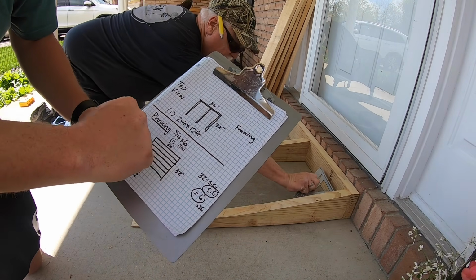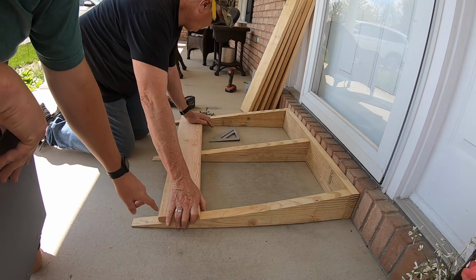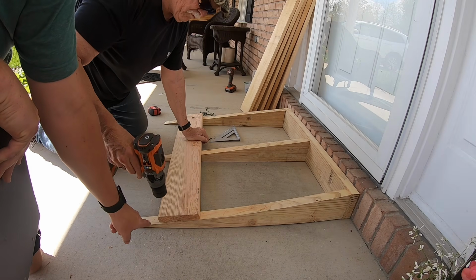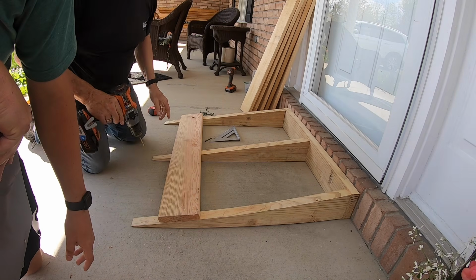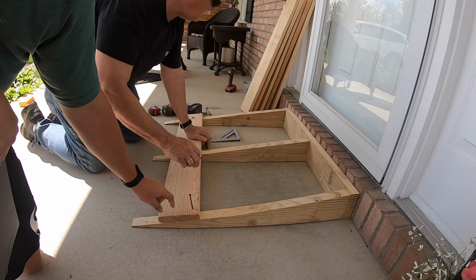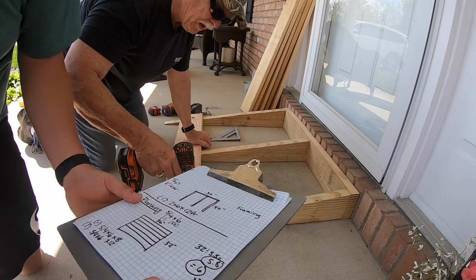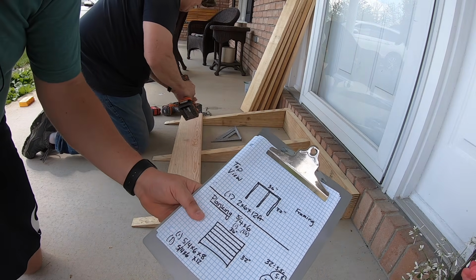Remember, those were 36 inches long. That is that 5/4 board. One of the things you want to do is go ahead and put one, I know it looks weird, and tack it in down here. You will want to pre-drill at least the end pieces here and here. You don't necessarily have to on the middle one. You don't want them to split when you're screwing it down. Also, when we get down here, we are going to have to go at a pretty steep angle, but this will just keep it at that 36 inches and keep it locked in place so all of your runners work just how they should.